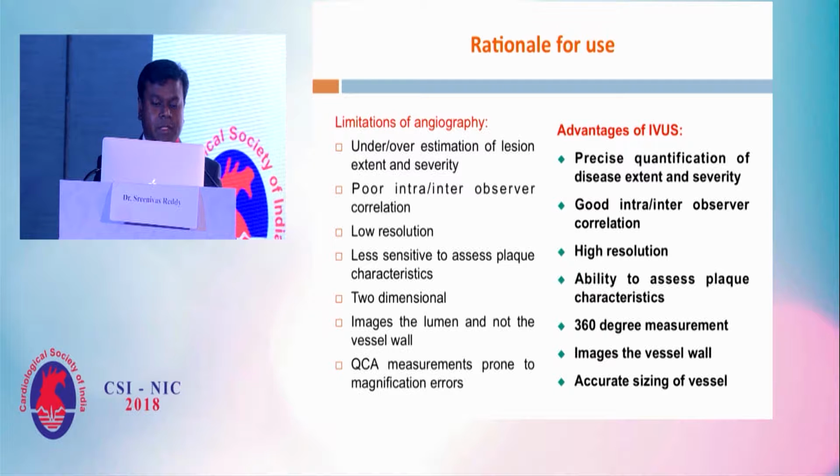The advantage of imaging, especially IVUS, is that it gives precise quantification of disease and extent of severity, good inter- and intra-observer correlation, and high resolution. It's able to assess the plaque, gives 360-degree imaging, and actual sizing of the vessel walls.